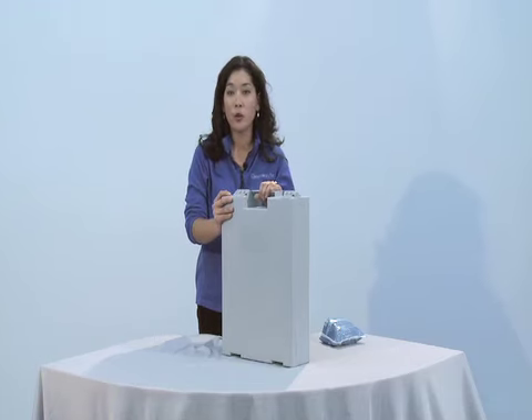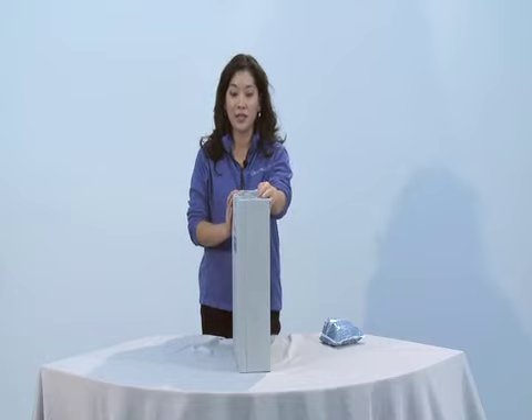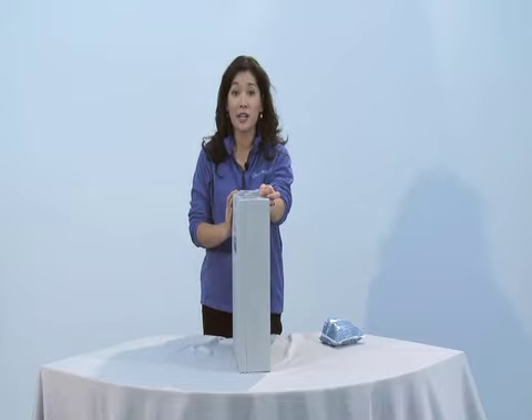Want to go in comfort? The Go Anywhere toilet kit folds up to the size of a briefcase — 5 inches by 14 by 19 — and is the same height as a standard toilet.